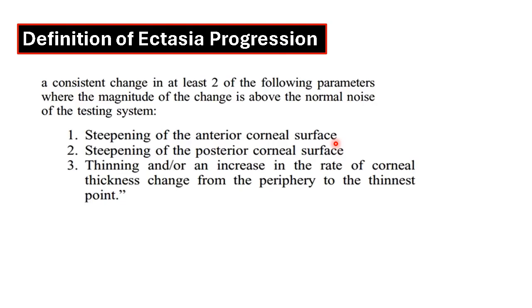The noise of the test is analyzed by what is called statistical noise analysis. Noise means that some of the data taken may have a large rate of fluctuation beyond the normal, and this fluctuation is not because of the observed data, but is due to errors or bias made by the machine, by the doctor himself, or by the sampling itself. So by special statistical analysis, they can remove this background noise, so that the observed data will be on a solid background to document that there is a progression in the case.